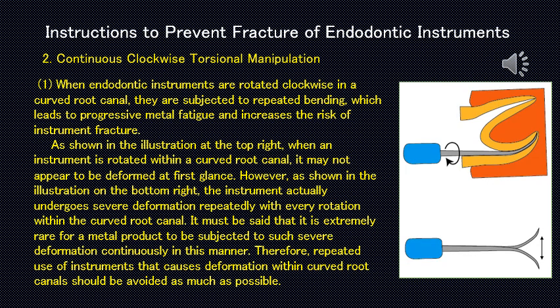It must be said that it is extremely rare for a metal product to be subjected to such severe deformation continuously in this manner. Therefore, repeated use of instruments that causes deformation within curved root canals should be avoided as much as possible.